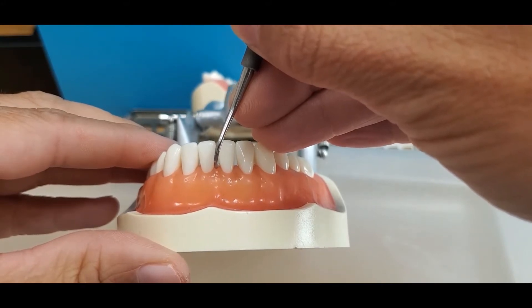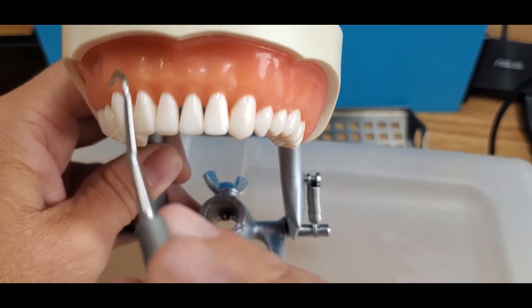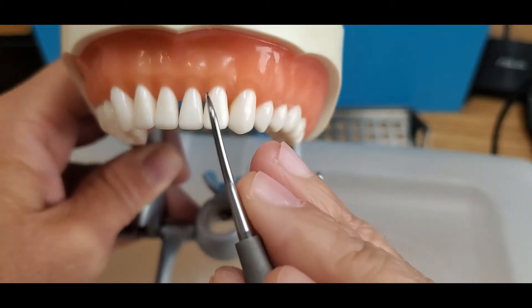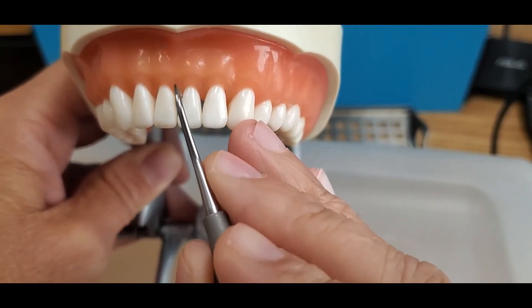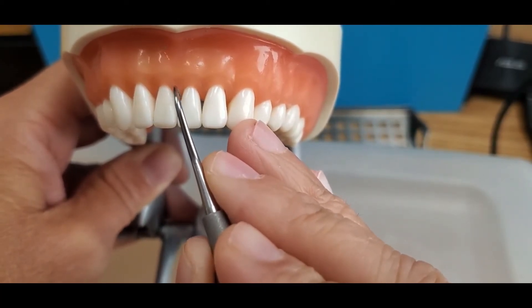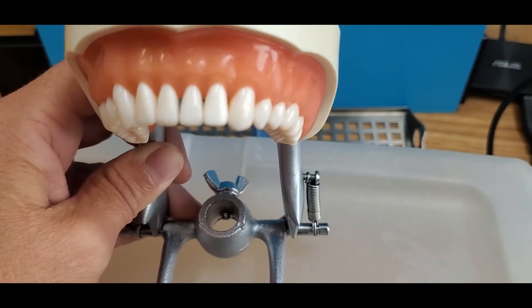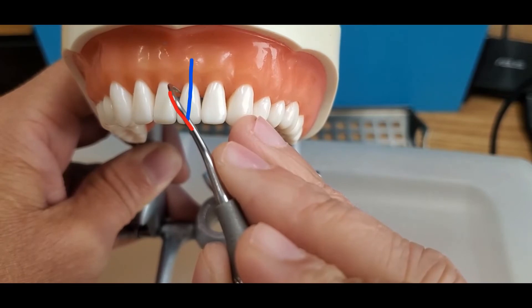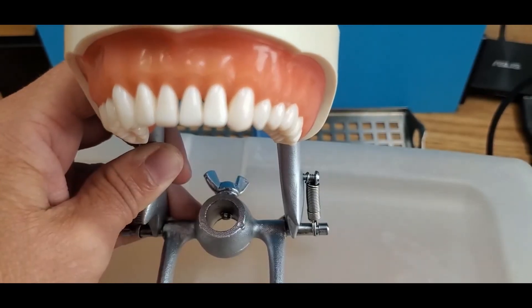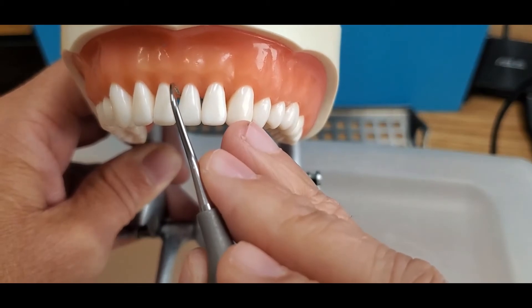This is the sixth end. When working on the away surfaces, working mandibular anterior surfaces away sitting at 12 o'clock, fulcrum on the canine, hold the instrument on the central, and again look for the end where the terminal shank is more parallel. This end you can see crosses the tooth. This end is more parallel.